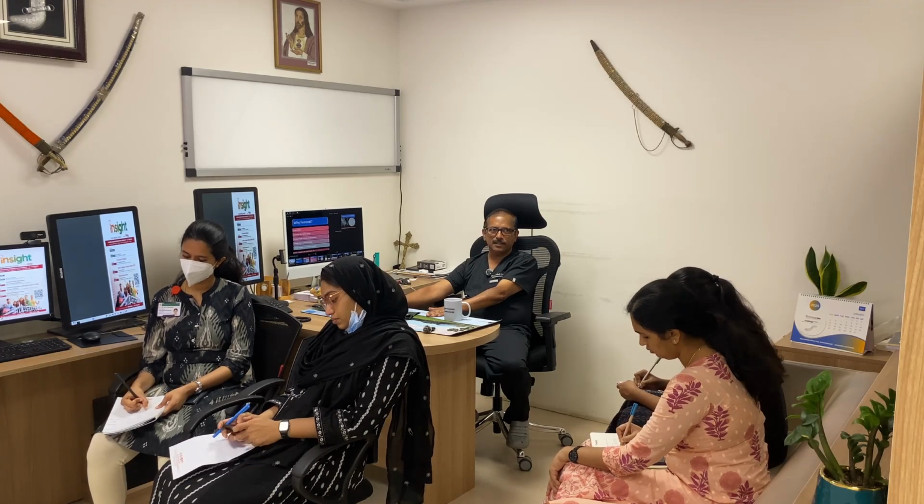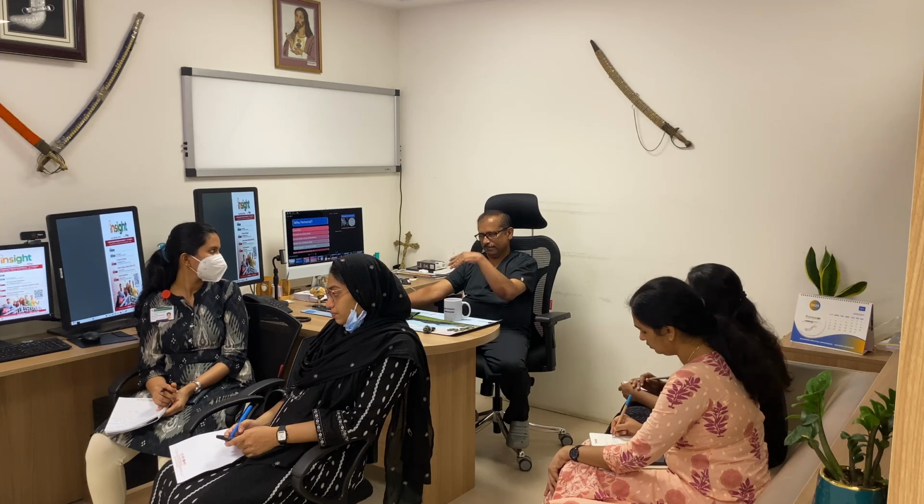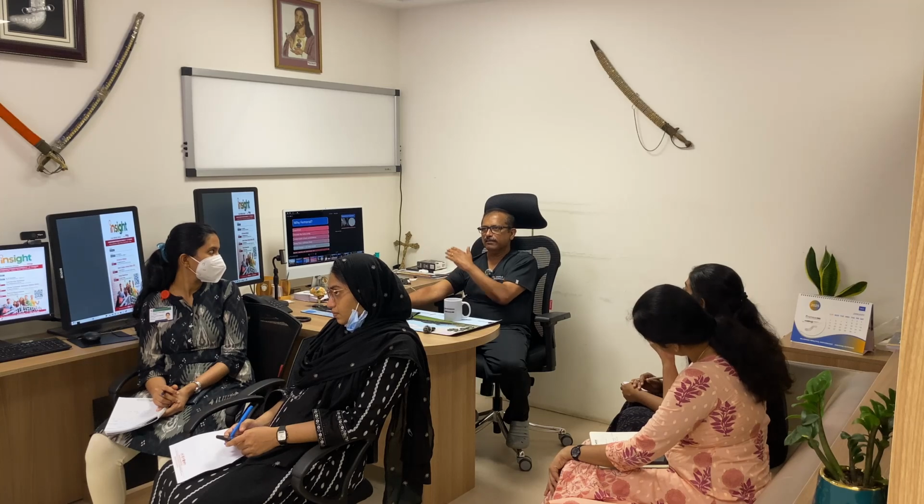Second thing is that it's slightly away. If you are looking at brain intervention, it's away from the radiation field. You know the inverse square law. What is inverse square law? It is the square of the distance. The most important thing is to keep away. If you want to be out of the radiation, you have to be away from the radiation source. So if it is slightly away, even if it is 5 centimeters away, you will have a lower dose.